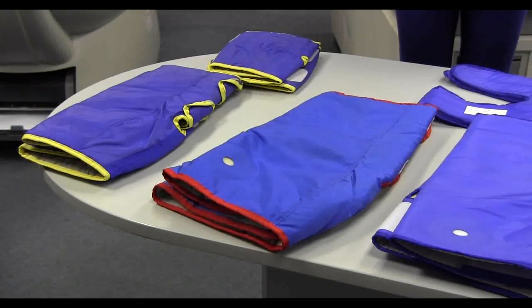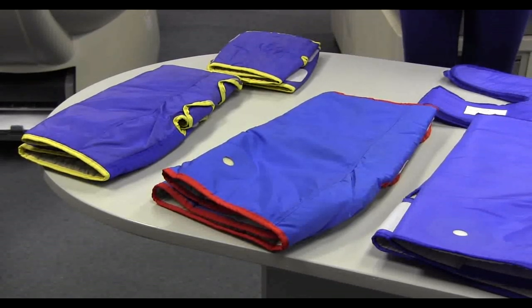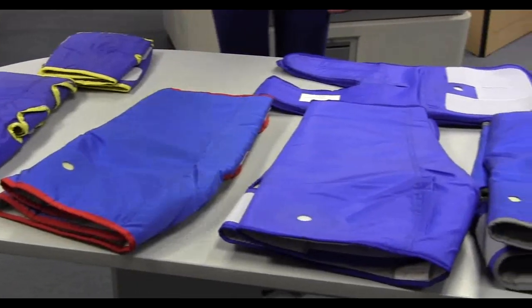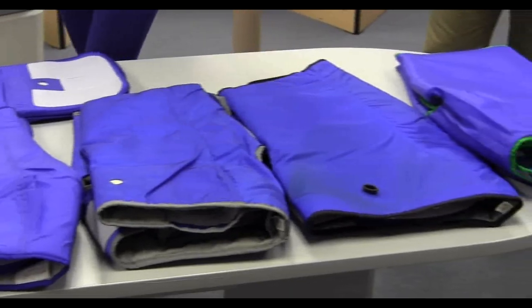EECP cuffs come in six different sizes: extra small, small, medium, large, extra large, and double extra large.